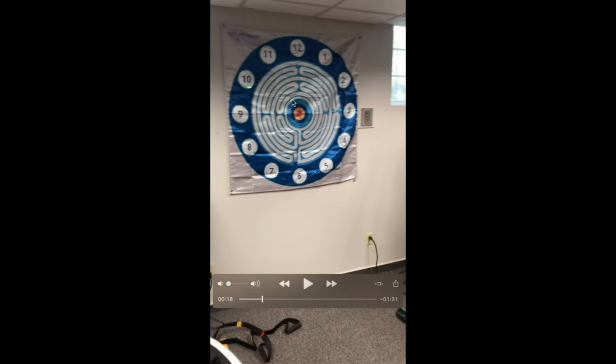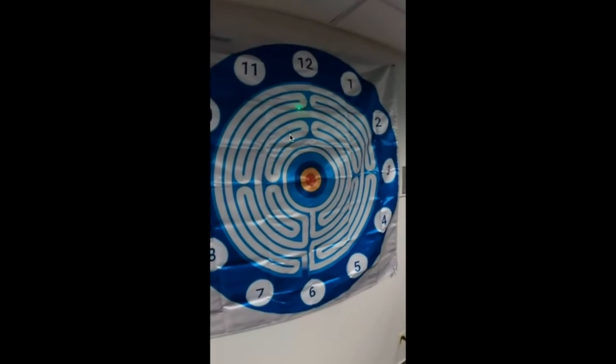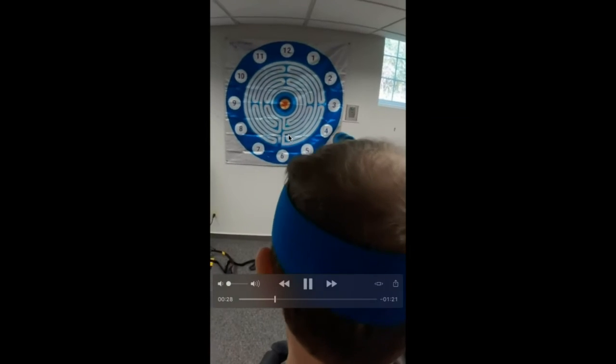He's also going to show a person working through the maze with this particular setup here. So you'll see the target move back and forth on the clock, and then moving around the maze.